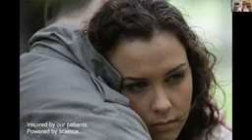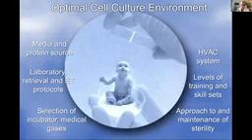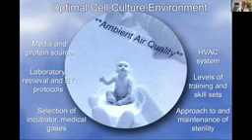As many of you, as a lab director for decades, an embryologist, we're all driven to try to remove or control variables. As Jason Swain shared, there are countless variables that are going to impact our cellular and clinical outcomes. And so we all strive to try to remove and control as many as we can. One that was particularly elusive to us in our laboratory was that of the ambient air quality.